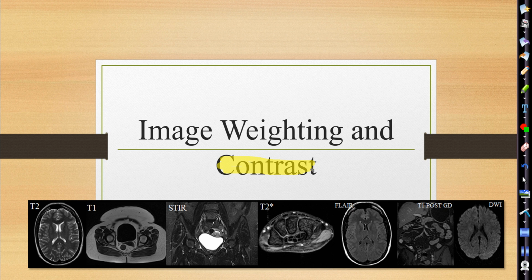There's less shades of gray. Less shades of gray, so more black and white, and a greater distance between those shades of gray, right? What does it mean to have low contrast? Many shades of gray, smaller distance between each shade. So typically with X-ray, where do you want to have high contrast, what body part, and where do you want to have low contrast?